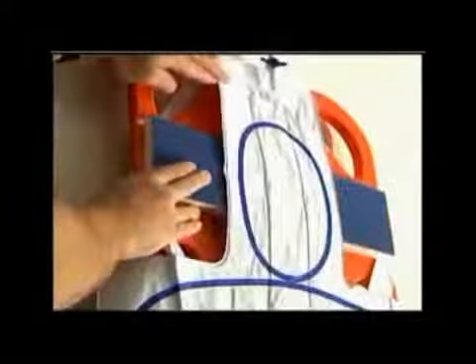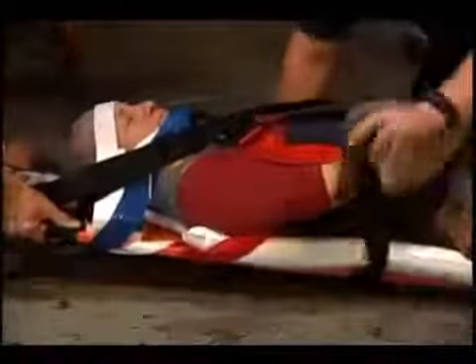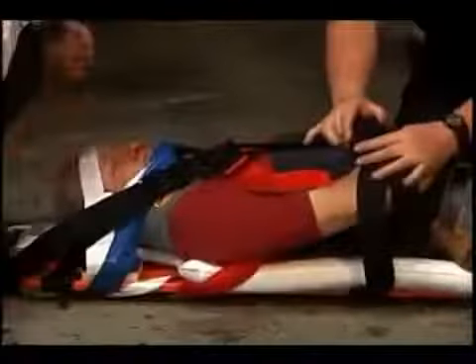The back raft is designed to accommodate most cranial immobilization devices, or CIDs. Be sure that any CID that connects left and right sides is placed under the back raft, not over. A good rule of thumb to remember is that the entire back raft should be touching the patient. To remove a patient off the back raft, simply deflate by opening the inflation valve and remove the patient off the board according to local protocols.